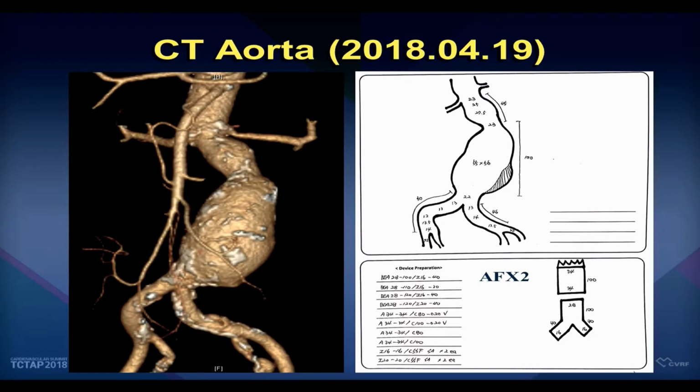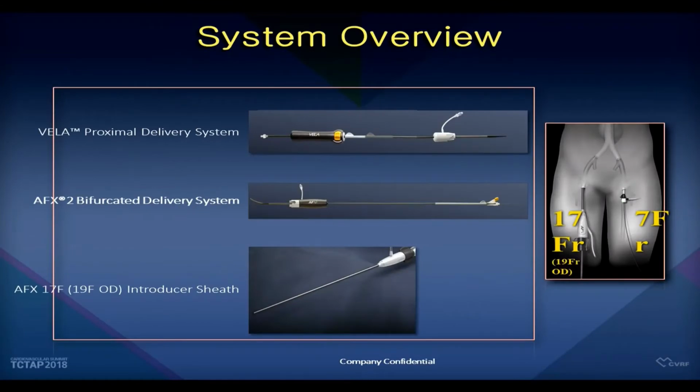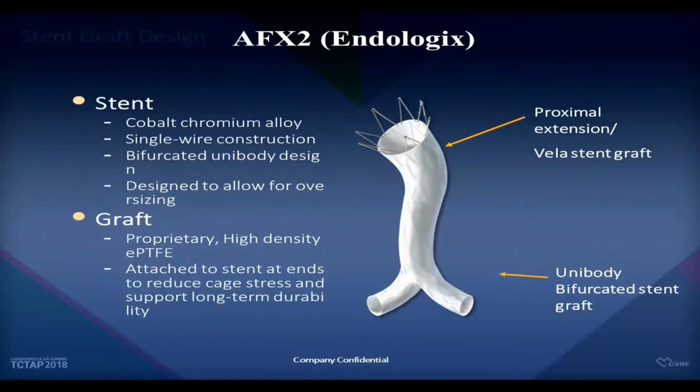Could you click the slide? Forward. So we'd like to use the AFX2 device. This device has a unique design.